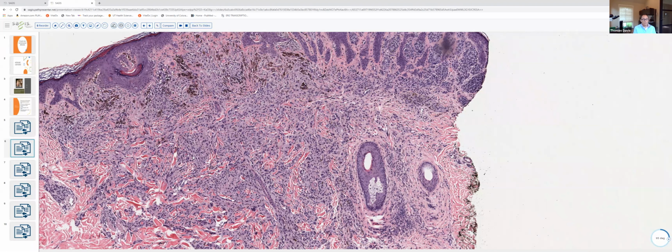Blue nevi, much like we saw with the dermal duct tumor and the nodular hidradenoma, or like we see with cylindroma and spiroadenoma, are not homogeneous in their cytologic elements. So in a blue nevus, the number and density of dendritic melanocytes, the number of melanophages, the degree of fibrosis and sclerosis in the stroma, and even the relative number of spindled, fusiform, and epithelioid melanocytes varies from lesion to lesion.